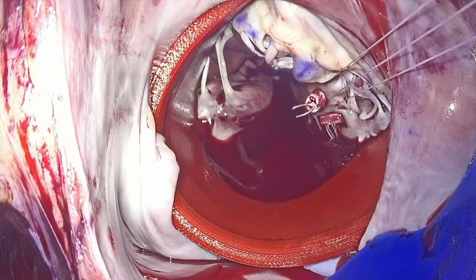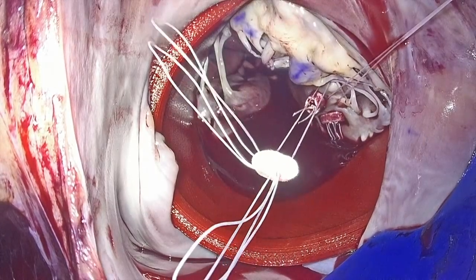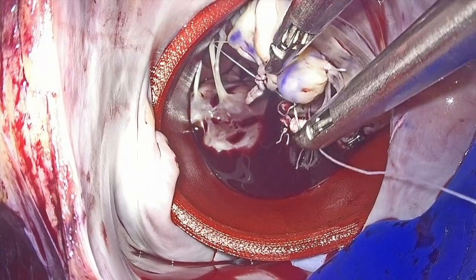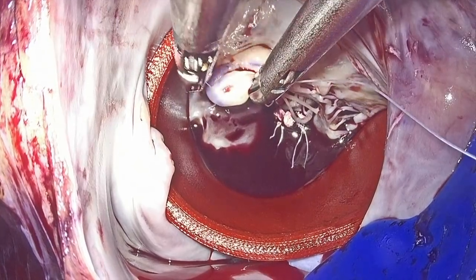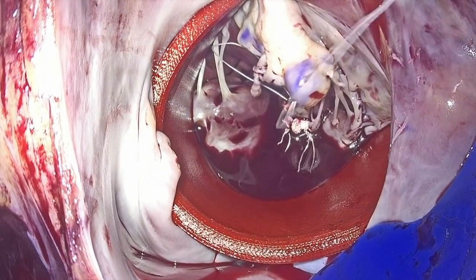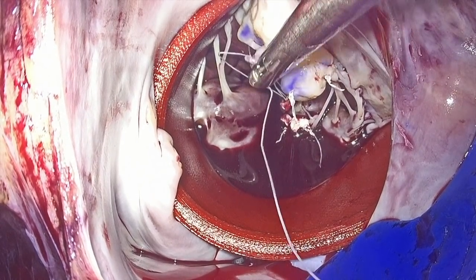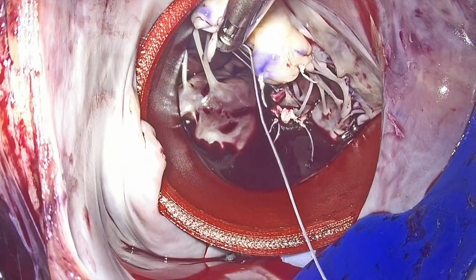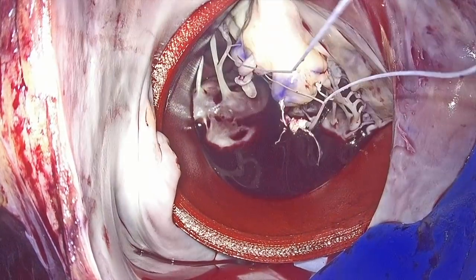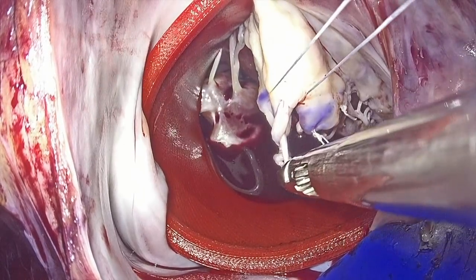A second pair of 22 mm length chordal loops were anchored in the posteromedial papillary muscle to be inserted in the corresponding part of the anterior leaflet. Before securing the last loop, we resected the ruptured chordae of the anterior leaflet.